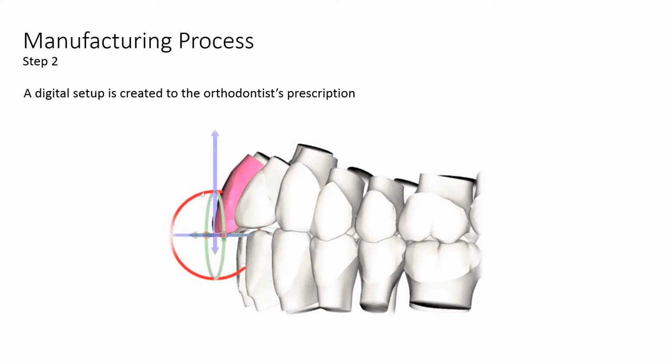So this is where we should have the opportunity, like you see here in this picture, to make changes in the setup relatively simply by drag and drop, to see the changes we are making, and to double check the treatment plan, whether it's according to what we plan to do.